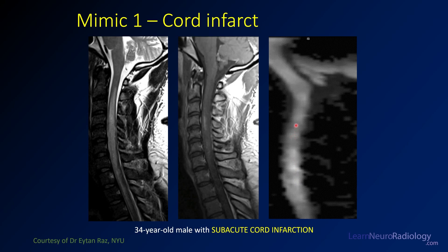For the cord, anywhere that's different from an adjacent segment of normal cord would be considered abnormal diffusion. If you see that and the patient has an acute onset of symptoms, think about an acute or subacute cord infarction — which was the diagnosis made in this case. That's a nice mimic to be aware of: cord infarction.